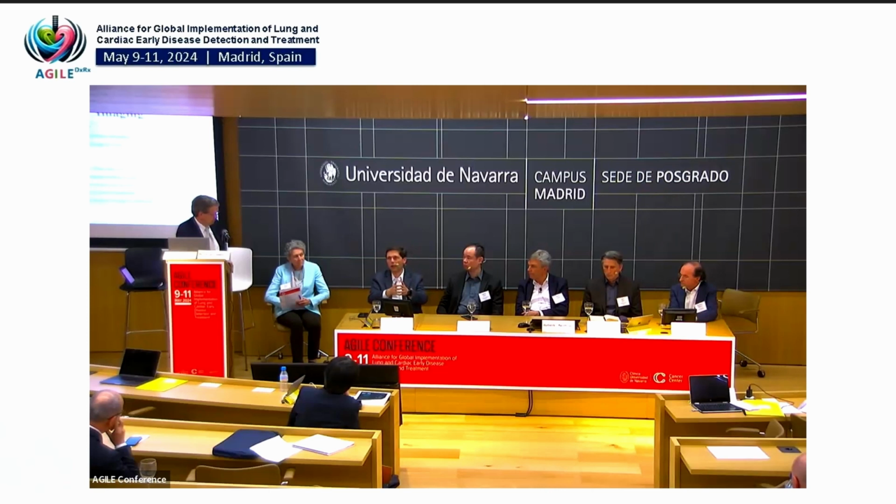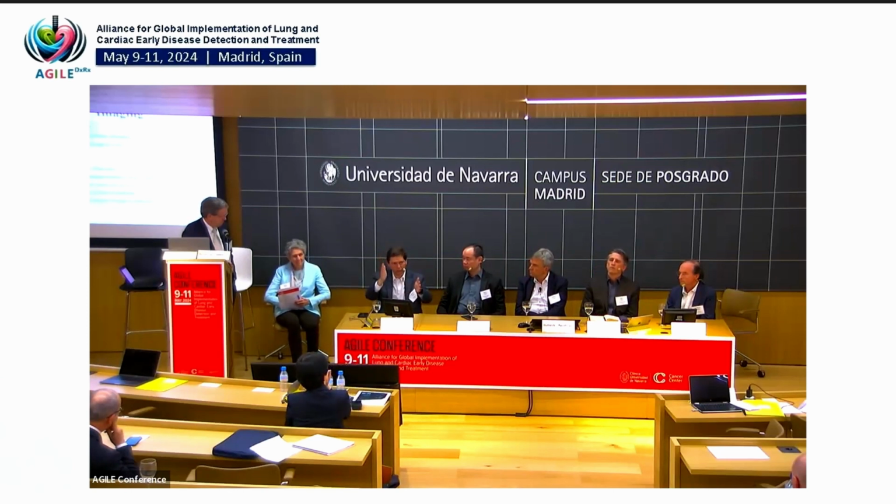Exactly. And that might not just be a scanner reconstruction, that might also be a post-processing reconstruction, or rebinning of the data. But we might also have additional reconstructions we'll need for other diseases.